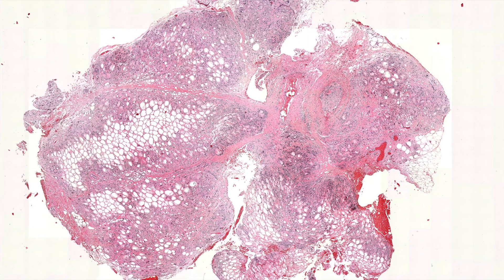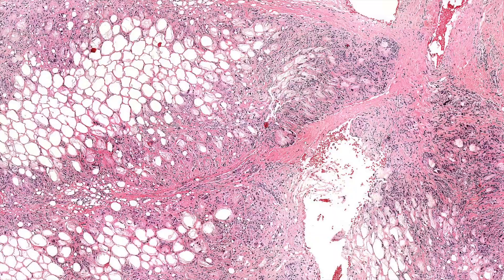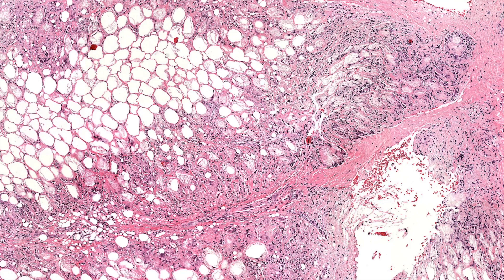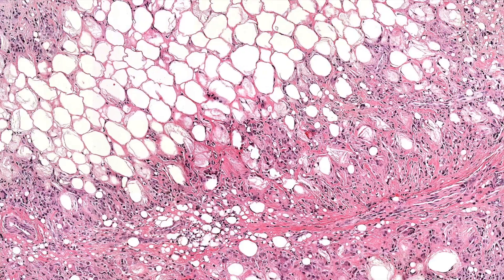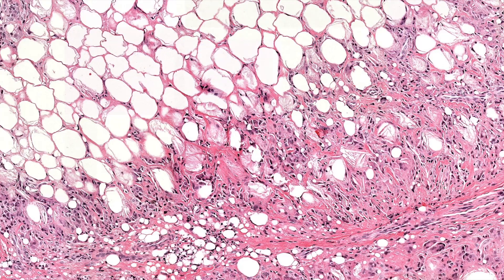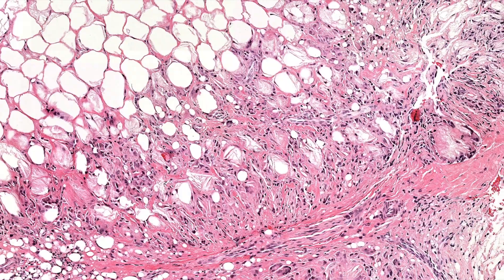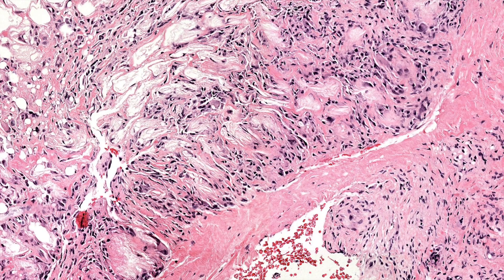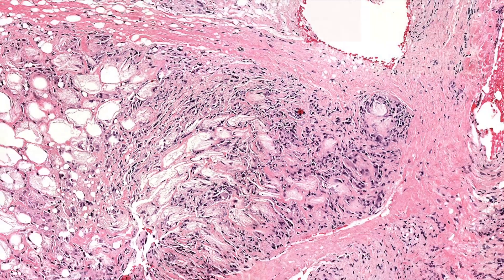Just coming into focus, I can begin to see some crystallization — that's the weird thing here. At low power it just looks like fat necrosis with a bunch of mixed inflammation, but closer up, the only thing I know that shows crystallization like this is subcutaneous fat necrosis of the newborn.